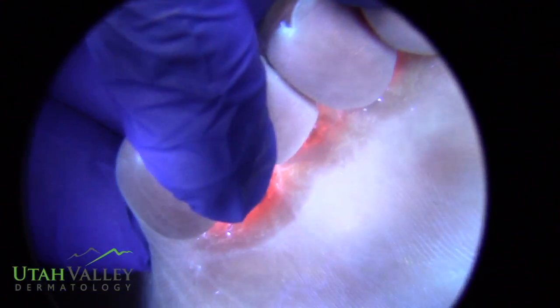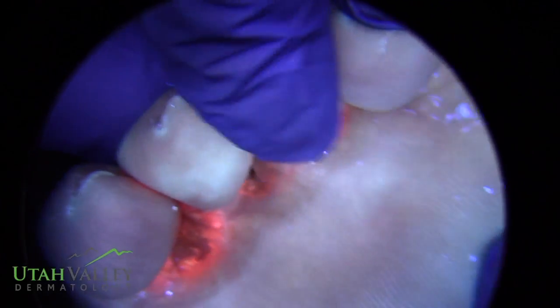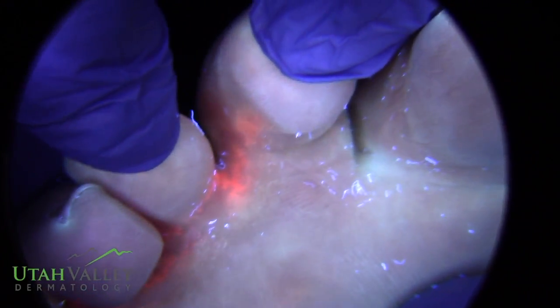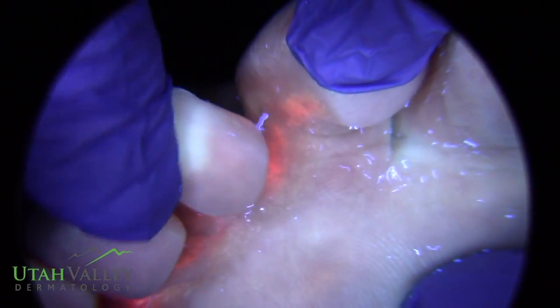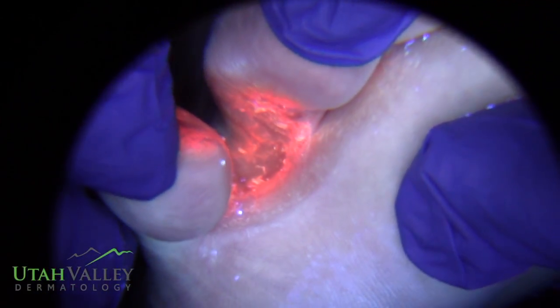Go ahead and turn the light off. With Corynebacterium, this is a really good example — you can see all that orange in between the toe web spaces. It really lights up with that coral red or coral orange-like color, and this is really classic. Look how amazing that is.